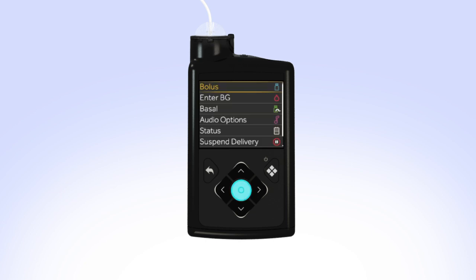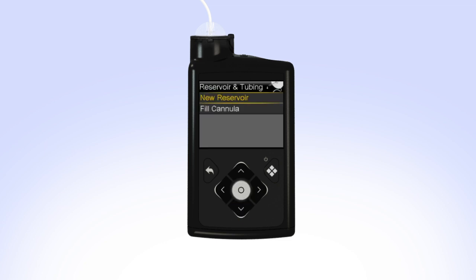To begin, press Select. Scroll down and select Options, then Reservoir and Tubing. Select New Reservoir.